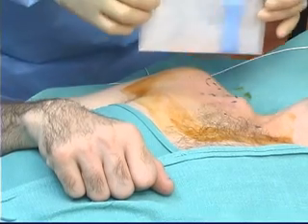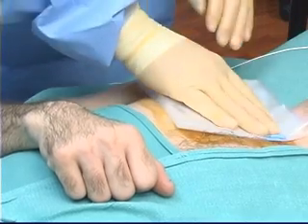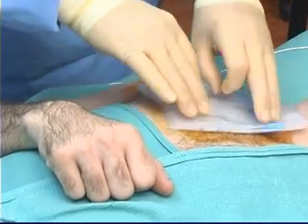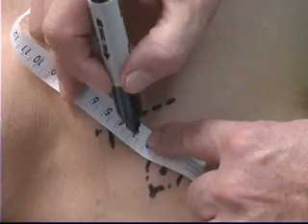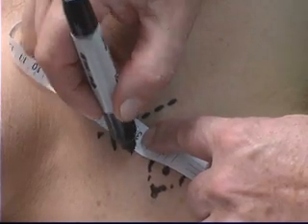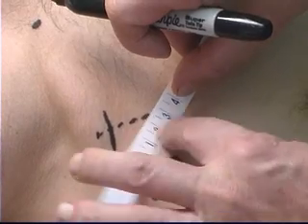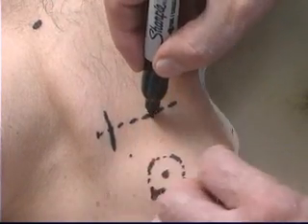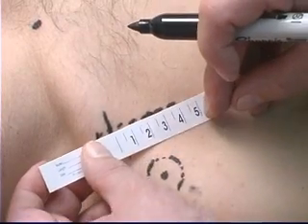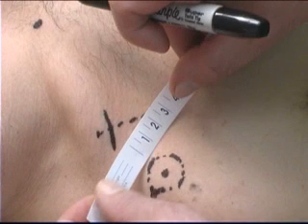The patient is positioned in the supine position with a hand placed on the abdomen. After skin preparation, the area is covered with a sterile fenestrated transparent plastic drape. The surface landmarks are similar to those of the single injection infraclavicular block: one thumb, the width of the patient's thumb, medial, and one thumb caudad of the coracoid process. Another approach is one thumb caudad on a line from the midline of the clavicle. The circle here indicates the coracoid process.